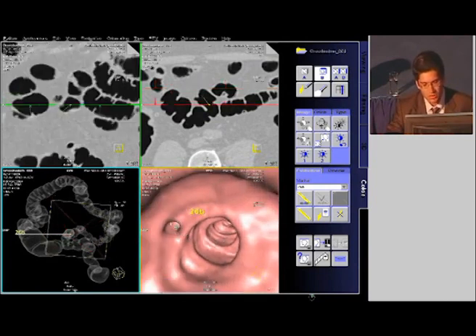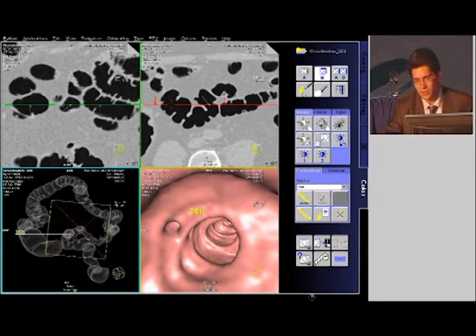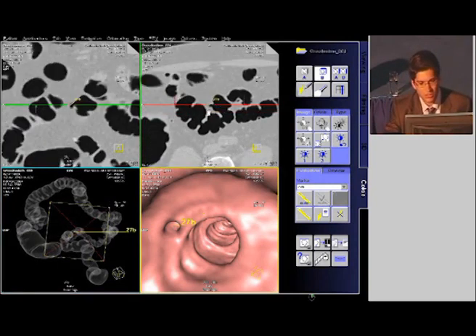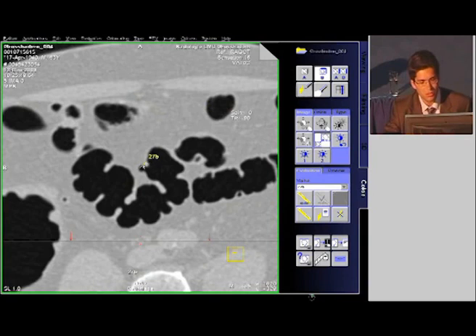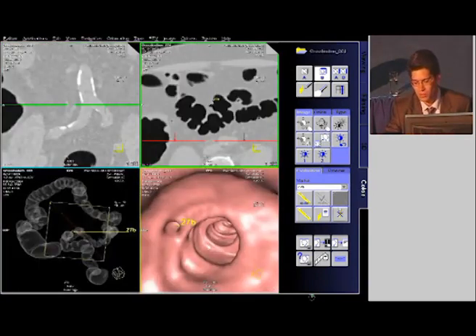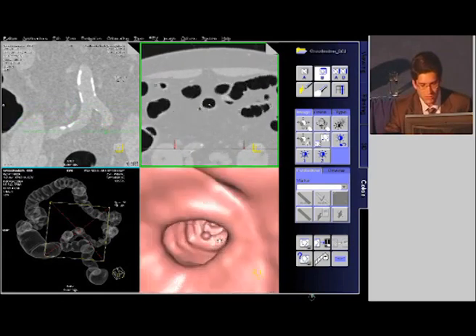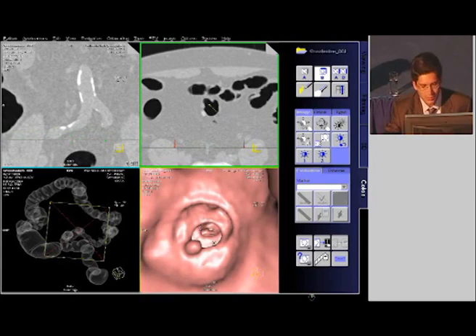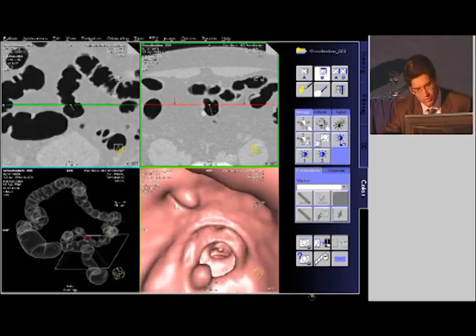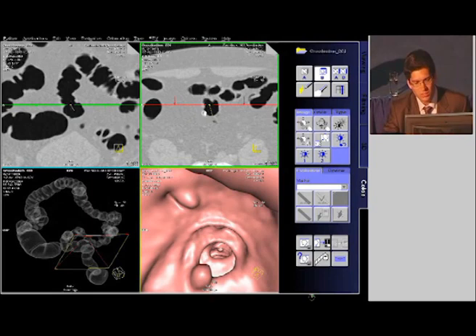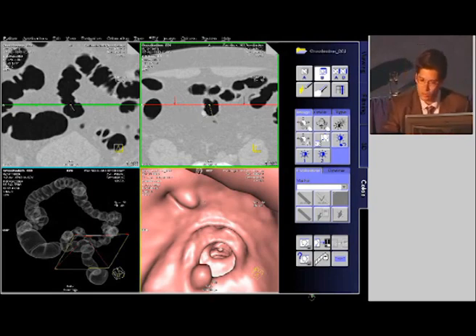This is something else you are frequently going to encounter in many patients — it is a diverticulum, which after having seen a number of cases you will easily recognize. But just in case you are not sure, put a marker on it, and you are right away going to see this black hole which is typical for a diverticulum. By double-clicking on this image you blow it up to full-screen format. As we move on, there are more diverticulae and another polypoid lesion we are now approaching. There is also a classical appearance of an inverted diverticulum — it's a diverticulum fully filled with residual stool, so you will never get them all free of stool. This is a classical appearance of that.